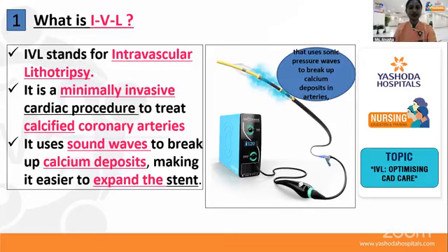We will learn about what is IVL. IVL stands for Intravascular Lithotripsy. It is a minimally invasive cardiac procedure to treat calcified coronary arteries. It uses sound waves to break up calcium deposits, making it easier to expand the stent.